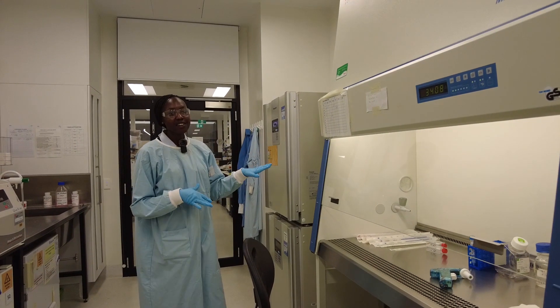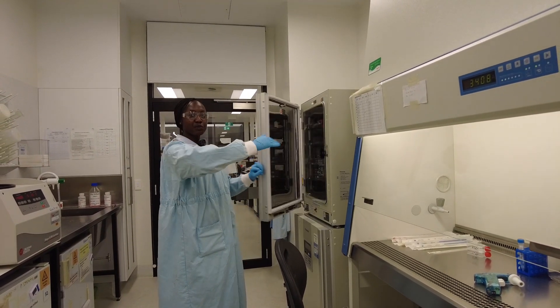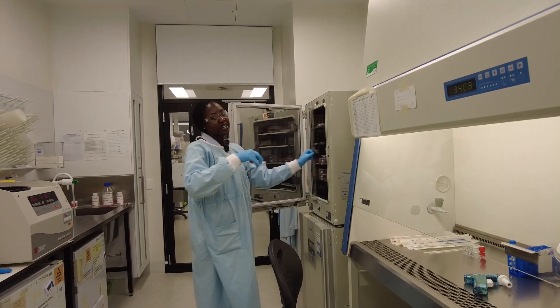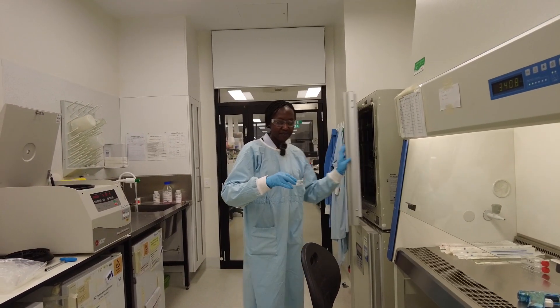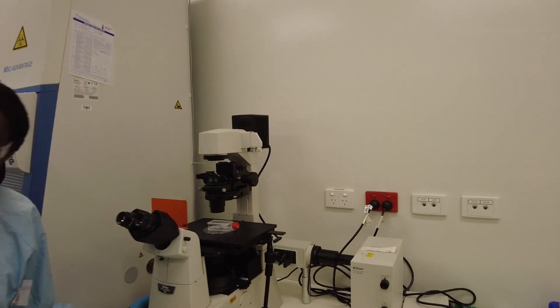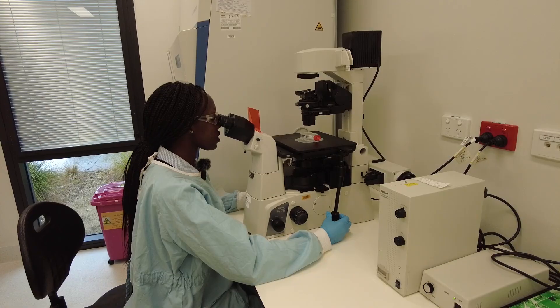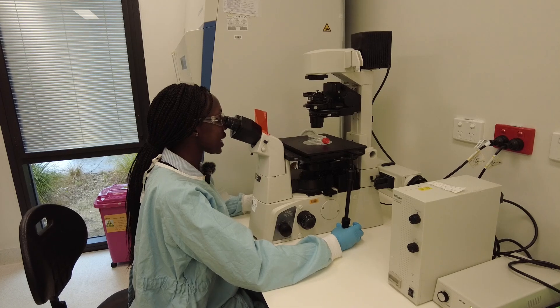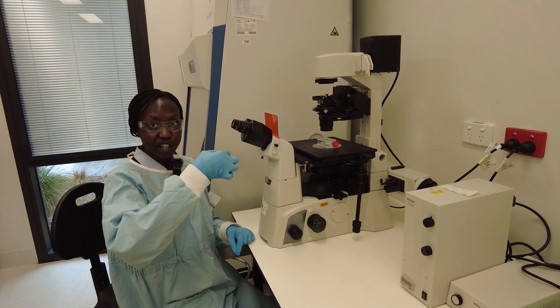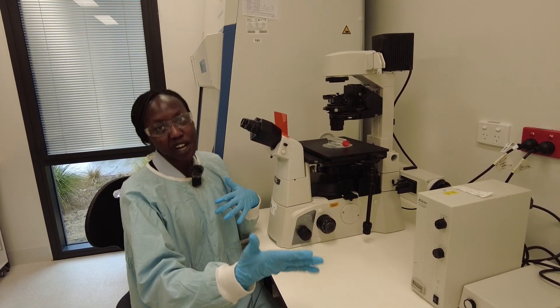So now we're going to check our flask to see if our cells have lifted from the bottom. What we want to see is our cells moving around, so we're going to check under the microscope. It's been about five minutes. When we look under the microscope, we can see that the cells are no longer elongated — now they're globular or circular because they have lifted off. When we transfer them and leave them overnight, they will start to take shape again.